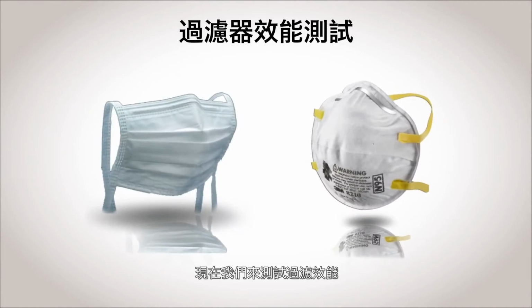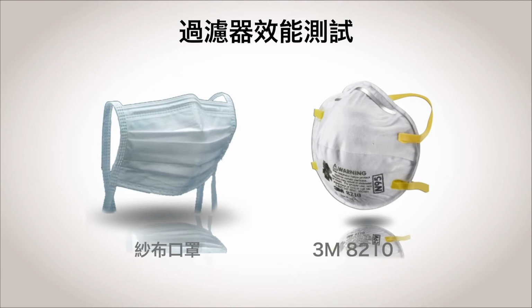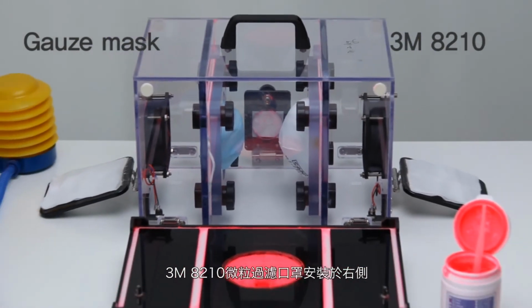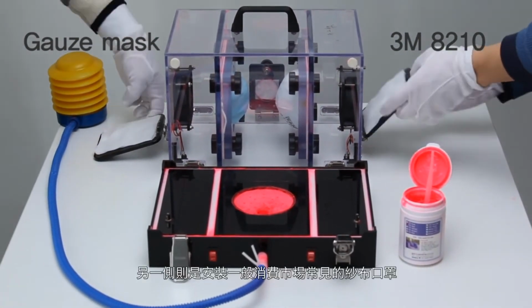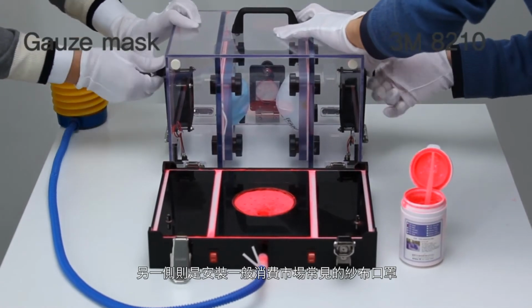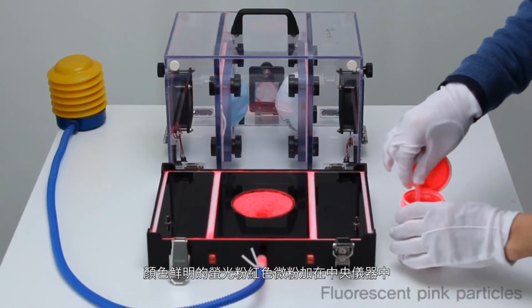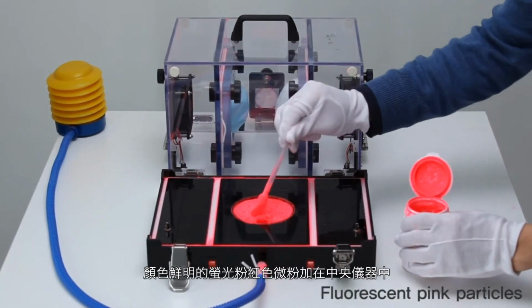Now we're going to demonstrate the filter performance with the gauze mask and 3M particulate respirator 8210. The 3M 8210 particulate respirator is on the right side. The other side is holding a gauze mask, which is commonly sold in consumer markets. The fluorescent pink particles, which have a distinct color, are added on the scale at the center.